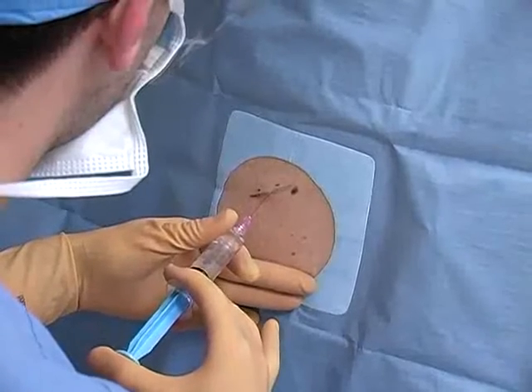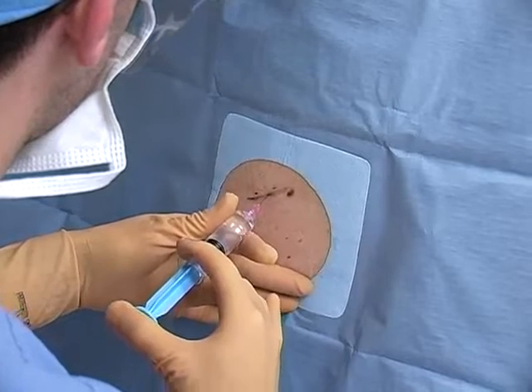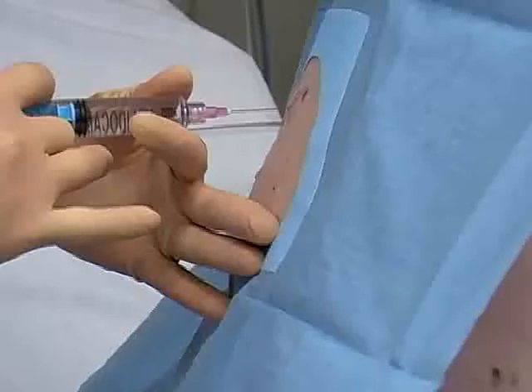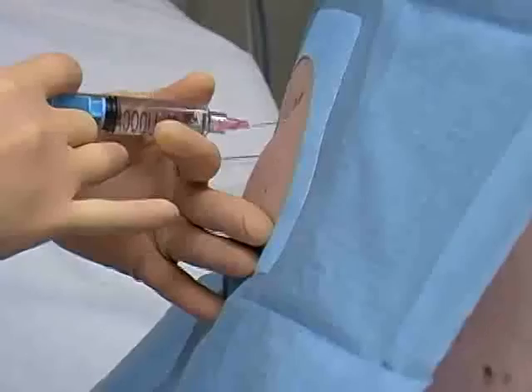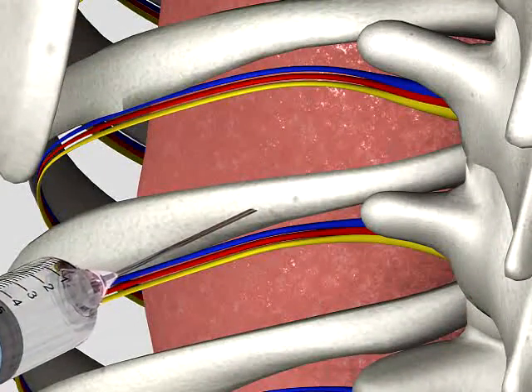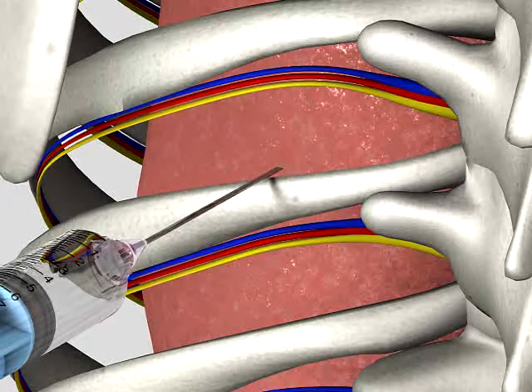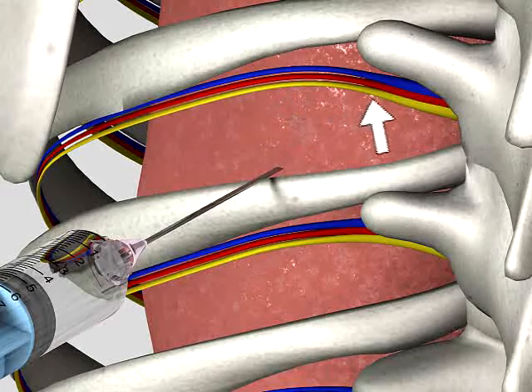Using a 25-gauge needle, place a wheel of anesthetic over the superior surface of the selected rib. Advance the needle through the wheel until it comes into contact with the rib, and then gently walk the needle over the superior surface of the rib. This technique avoids injury to the neurovascular bundle that runs along the inferior surface.